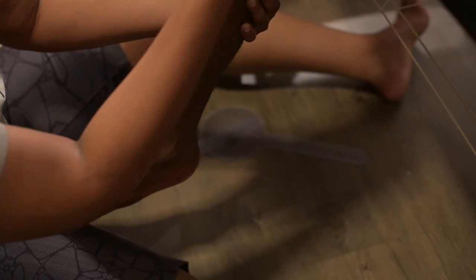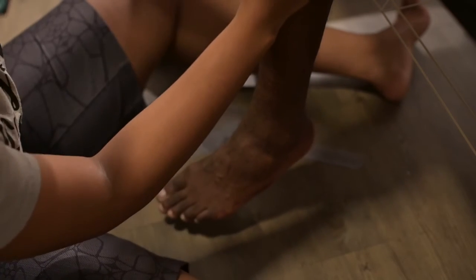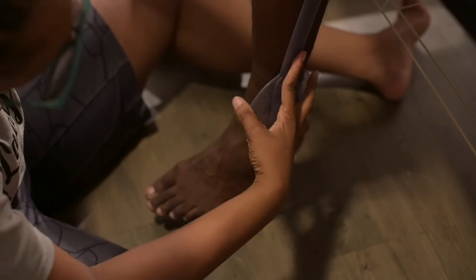This is the tibial tuberosity. So here it is. So here's the fibular head. So knowing that, this stationary arm will align there.